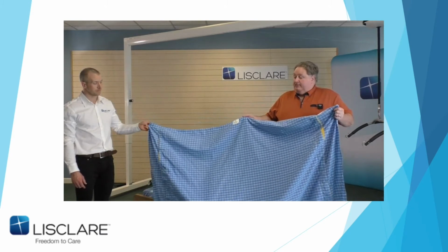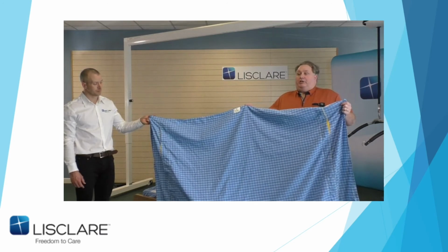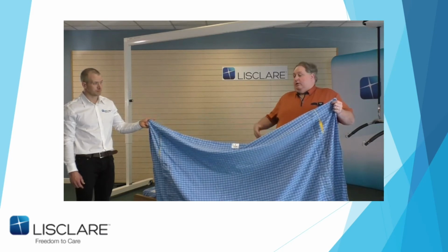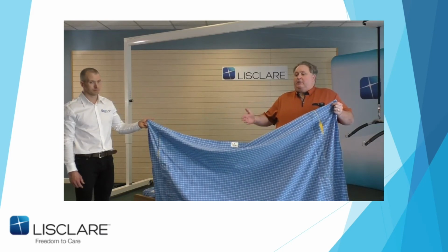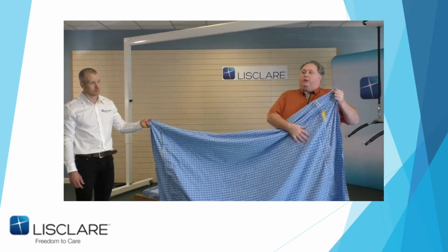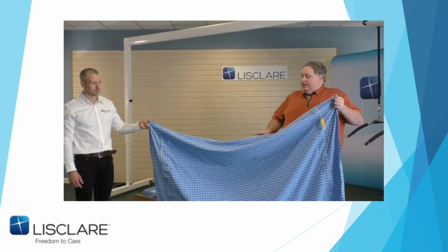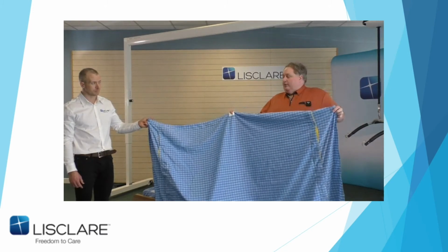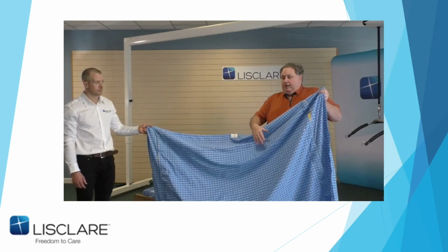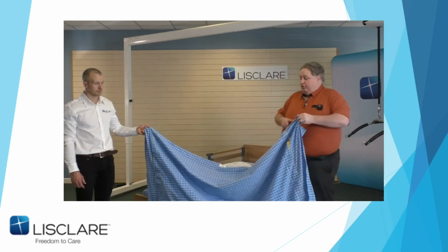The 3/4 sheet is the oldest form of manual handling in nursing. That's a draw sheet. That's exactly what that is. It means that it's always underneath the torso, because I've very rarely used the full length sheet in a bed, as I've always wanted the heels to be away from the friction area, especially for spasms and moving the patient up and down when you're profiling the bed. That's one of the reasons why training is involved in this a lot, to make sure that people understand that. That's why we even pressure mapped it to show it, because I was trying to keep the patient's heels free. Back to you, Stuart.